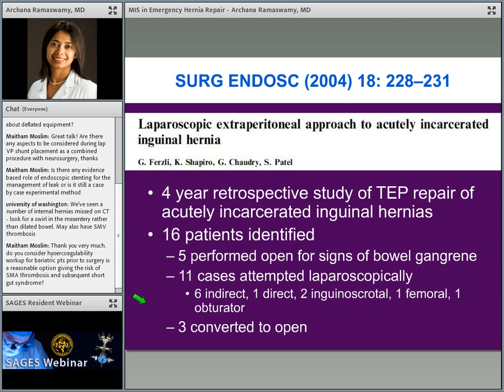So the caveats to laparoscopy. As has been mentioned before by Dr. LaMasters, with these patients who have potential bowel obstruction, open access is probably the right way to go. Veress, you may be very comfortable with it, but when you have dilated viscera, it may be a little bit scary. Bowel distension secondary to obstruction increases the likelihood of serosal tears or injury, so be very gentle with the tissue. And then there's the risk of adhesions if you've had prior surgery. And remember that you can get visceral injury if you have sliding hernias, such as the bladder.